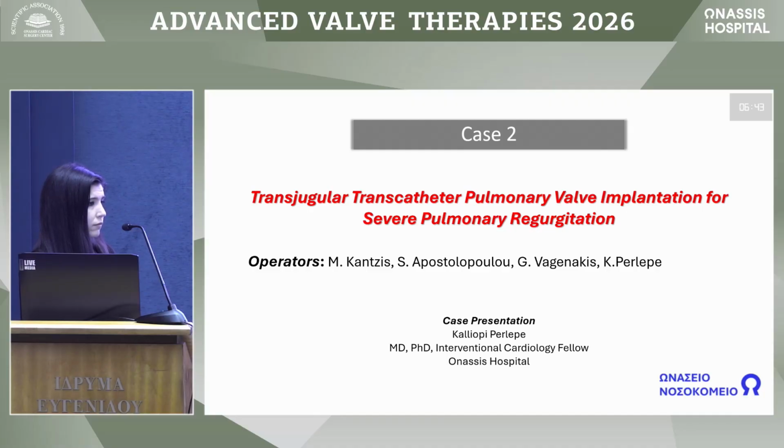That's why. This double balloon technique also offers us an open outflow tract in the right ventricle, because when you are expanding the balloons you do not have a circular shape of the two balloons but an oval shape, which means you are allowing a little bit of forward flow, so you do not totally reduce the cardiac output. In that way, you are keeping the patient more stable. Additionally, the force that you are applying will be in one direction, whichever direction the balloon sits, of course, but this is the way to do it.